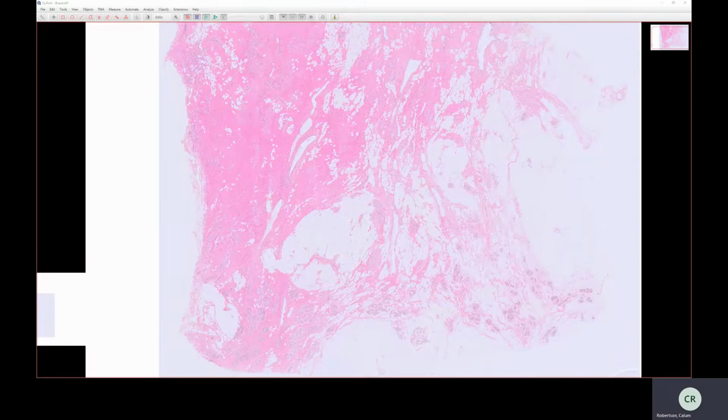Hi, this is Callum. In this video, we're going to talk about breast histology. There are two main types of breast specimen. You will get breast resection specimens and biopsies.